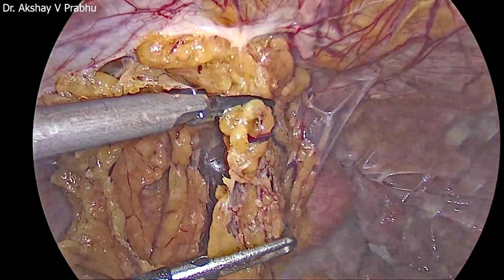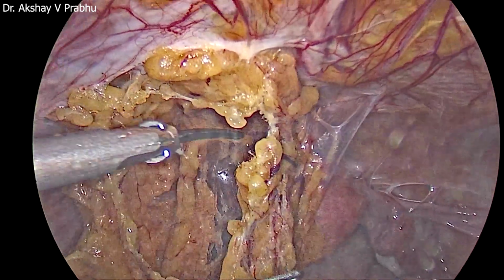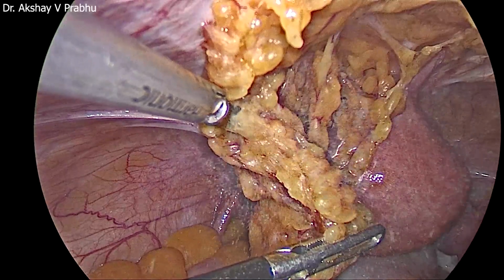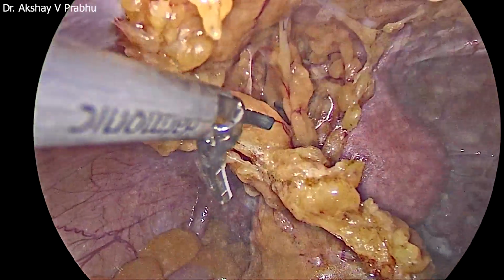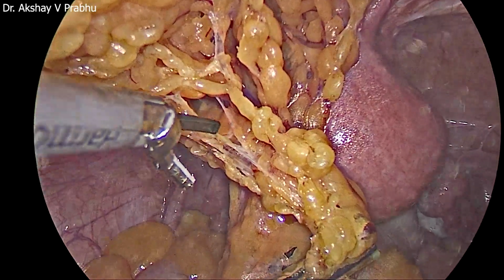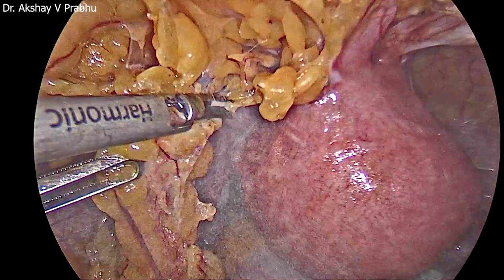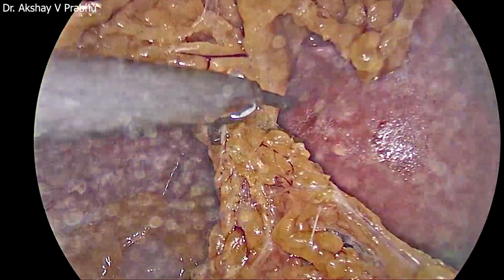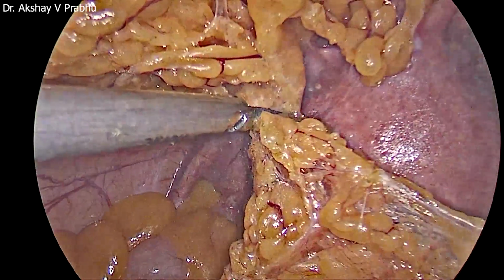So this is one case like most of you have been waiting for and have been repeatedly requesting me. This is a case of a total laparoscopic hysterectomy in a case of previous two cesareans. You can see the picture, the entire omentum is adherent to the anterior abdominal wall and also at the site of previous cesarean scars.